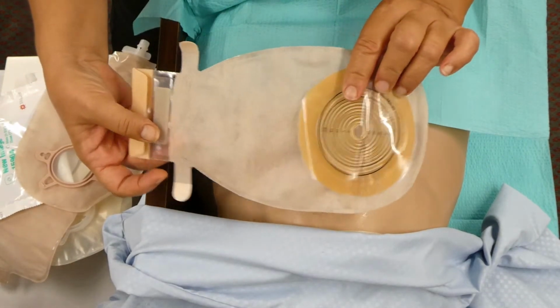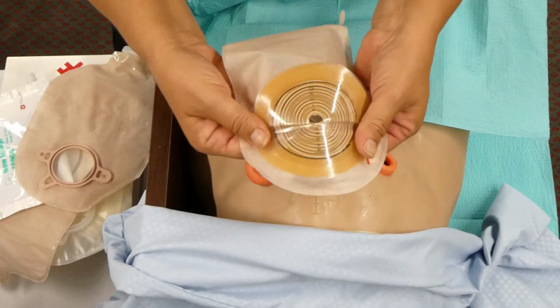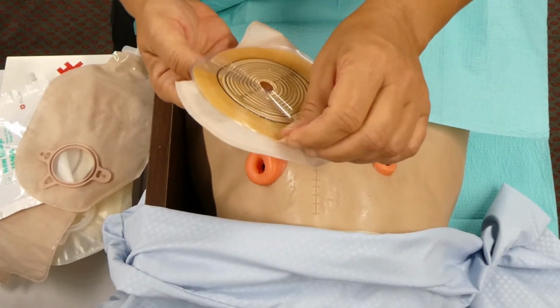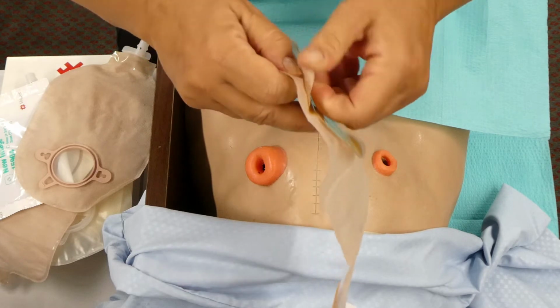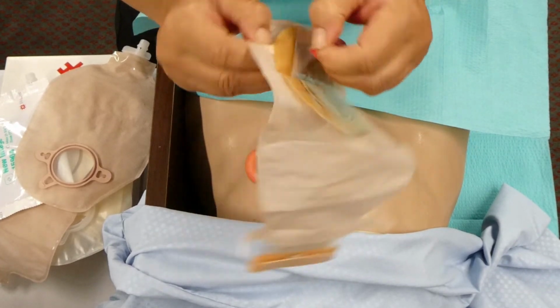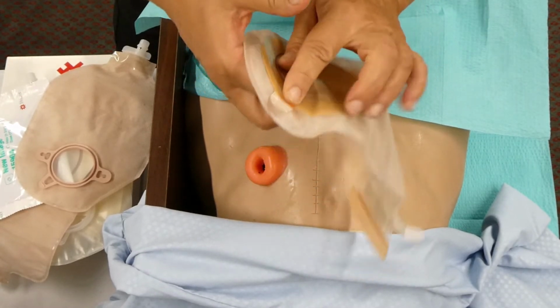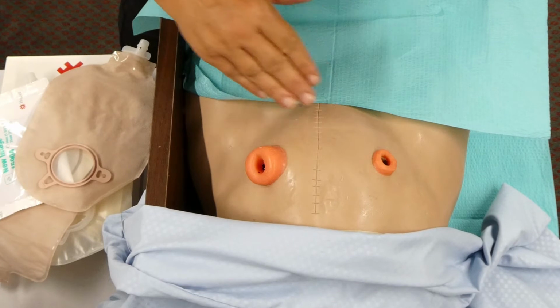So then you would cut this and then seal it over here. This has a peel off layer, as you can see here. And this peels off, revealing the sticky part. This is put on the skin and then rubbed.